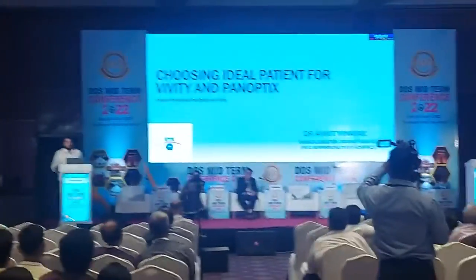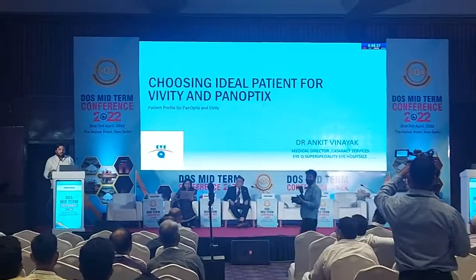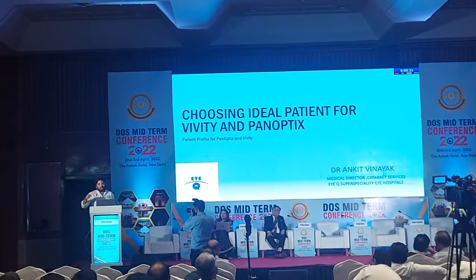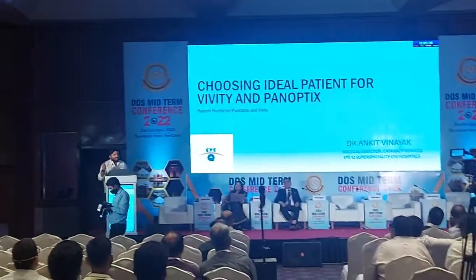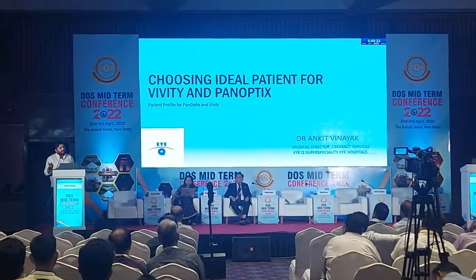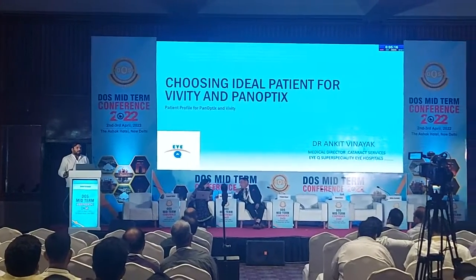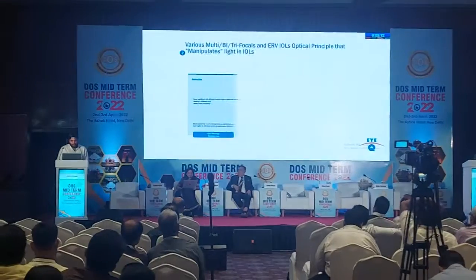Sometimes, just to give a background, I have changed a trifocal IOL for a patient who was complaining that on a mobile screen, the unlock pattern, the small white dots, she sees blur in that, and it was troubling her so much that I eventually had to go for an explant of the trifocal IOL. So we have to be open with all these options. We don't know which way things might turn. So just on that background.